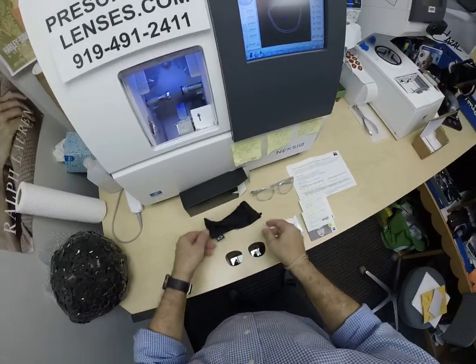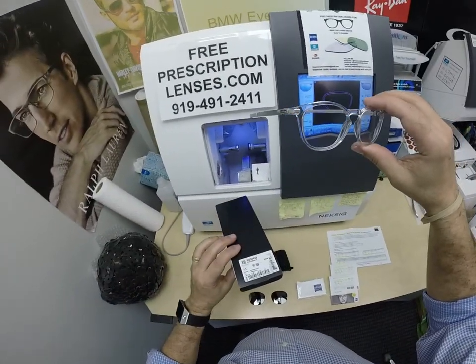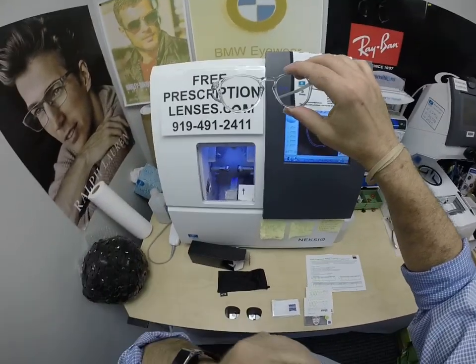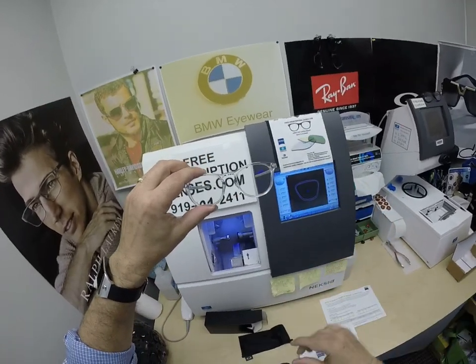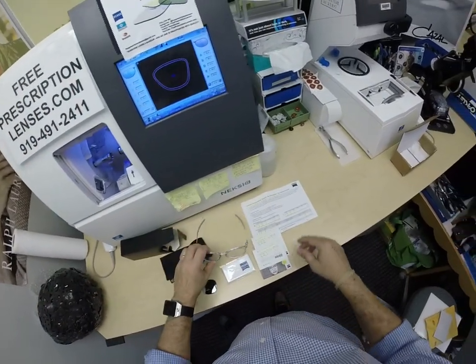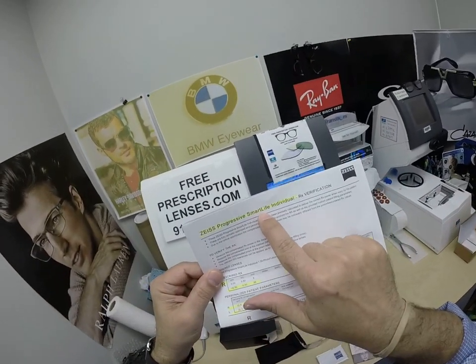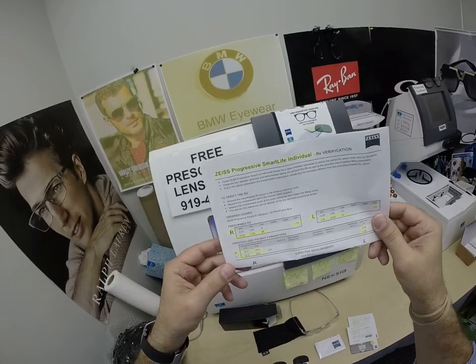And the star of the show, the main attraction — the Oakley. The model number is 9439. Now, I have this same frame, the Pitchman R Carbon, same color, same lens designs, except his lenses are nicer than mine. He got the Zeiss Smart Life Individual Progressive lenses — the nicest progressive that anyone could have.